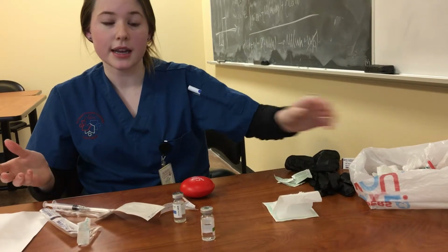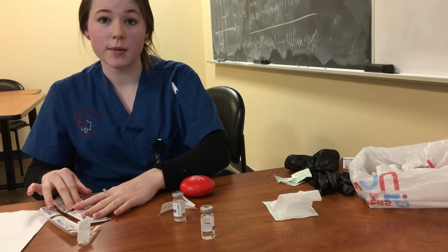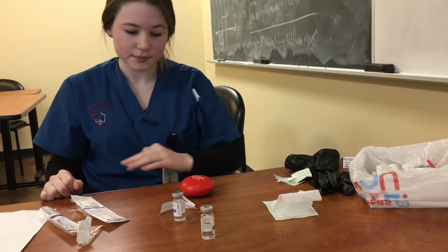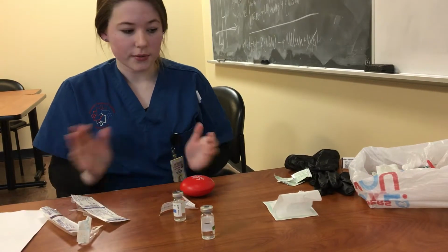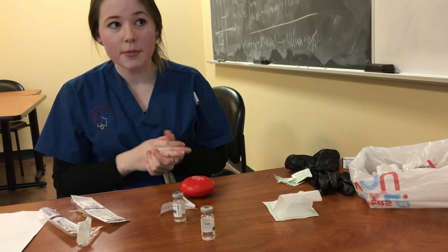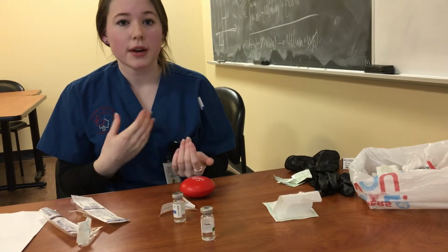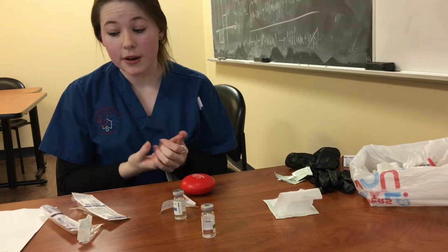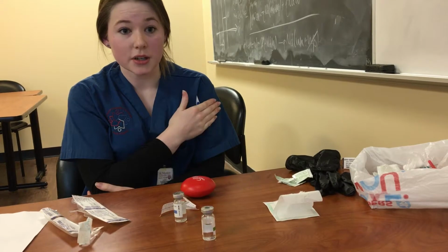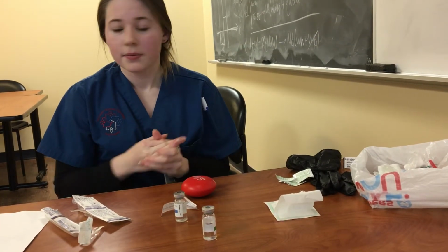And like always for any injection, I'm going to write on the packaging the patient's room number, name, and the medication, so I have all the information I need. And great, we're ready to go into the patient's room. So again, I would want to tell him, hi, I'm back here for your second injection today. I'd explain a little bit about Haldol, any of the side effects, what he could look out for. And because we are doing IM, I'm going to be going for the deltoid muscle. So there's a little bit more landmarking involved in that.